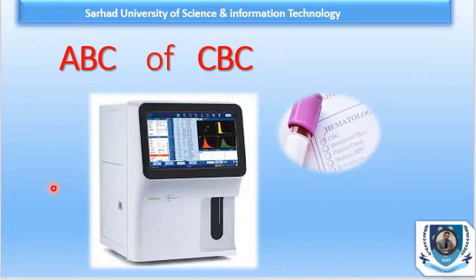Then further we had some very important discussion on RBC, and in RBC we discussed hemoglobin and red blood cell indices like MCV, MCH, MCHC, and RDW, red cell distribution width, and then we finally discussed the platelet count and mean platelet volume. Now in today's discussion, we will mostly focus on the hemograms, and basically these are the reports.